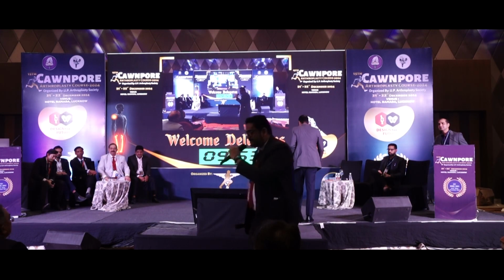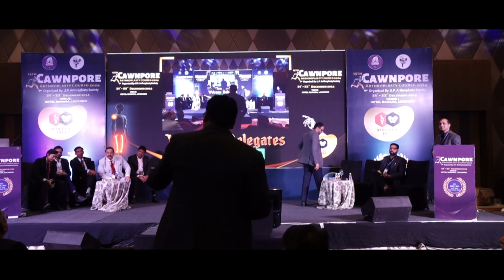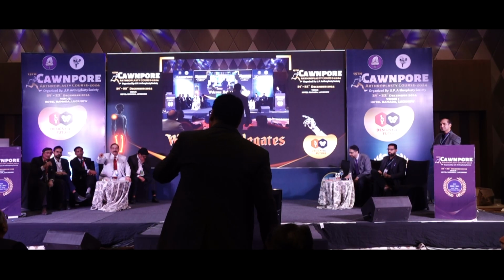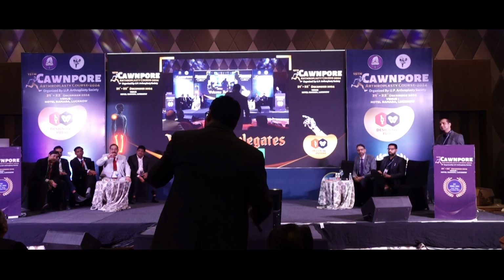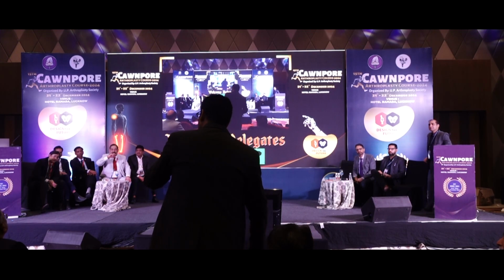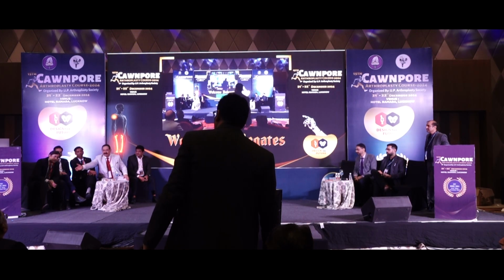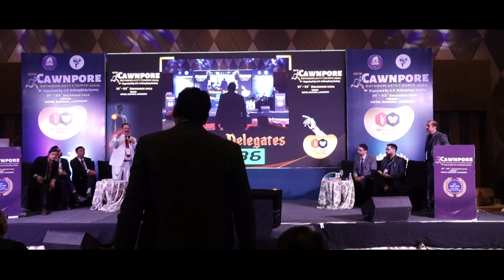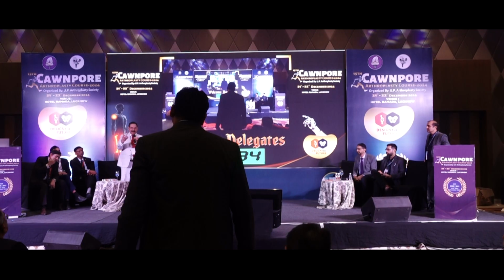In case you are managing the protrusio, you are aiming to get the fixation in the rim and wall. In the rim and wall. Yeah, entire rim. What is your take when there are osteophytes there also? Normally you are able to identify osteophytes very distinctly. It's not difficult to do so, isn't it?